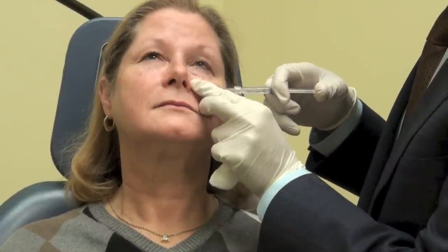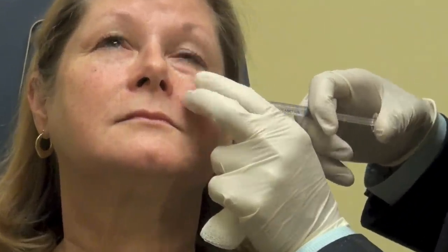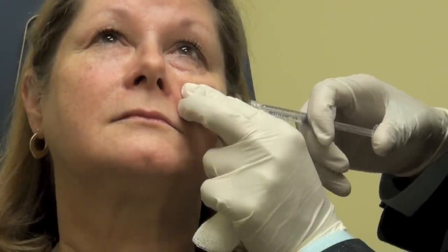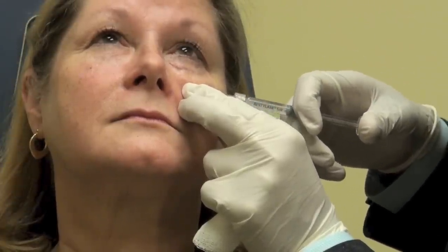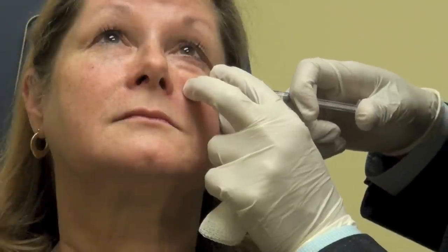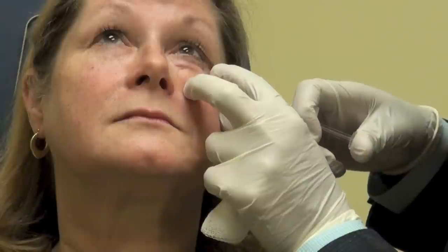What I'm doing is building the little dark circle, which is truly a valley or an emptiness. I'm building with Restylane Silk. Restylane Silk is nice because it has a little bit of lidocaine built into it. The particle size is more appropriate for lips, tear troughs, fine lines, and fine lip lines — anywhere you want a real soft and delicate filler. Because the particle size is smaller it tends to blend itself, doesn't need as much molding, and with less molding and less pressure we expect less swelling afterwards.